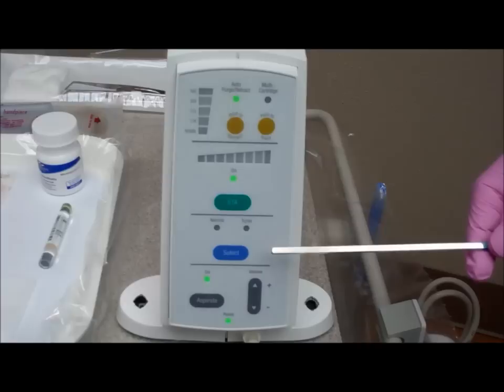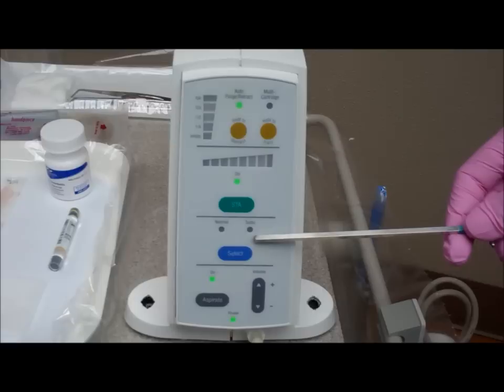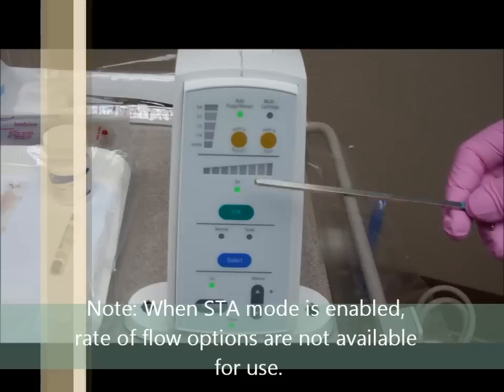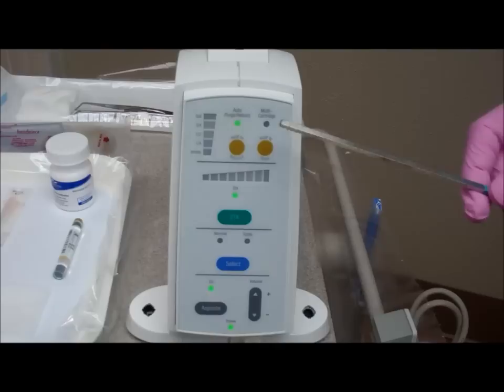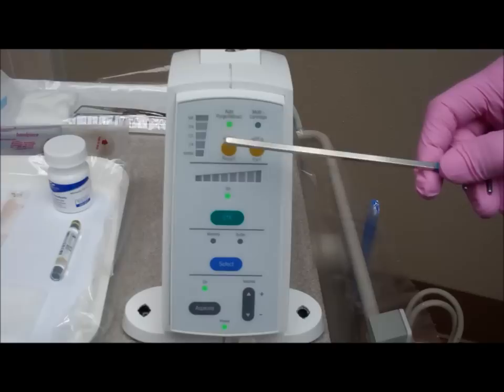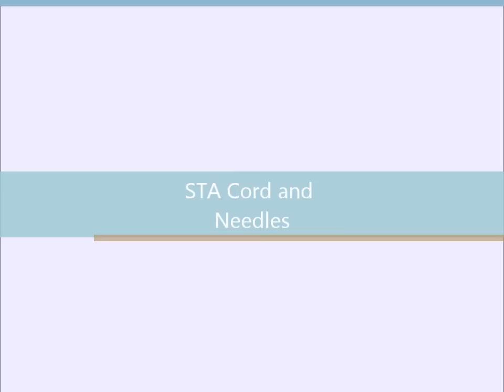Then we have rate of flow options. You can select normal or turbo, which is fast delivery. Then we have the STA option, which puts the device in STA mode — it is indicated as on right now. And then we have cartridge options. You have the option of selecting one cartridge or multi-cartridges, depending on the treatment you are providing. The indicator lights on the STA mode will light up indicating how much pressure you are applying, and the other indicator lights indicate how much anesthetic you have left or is being used.